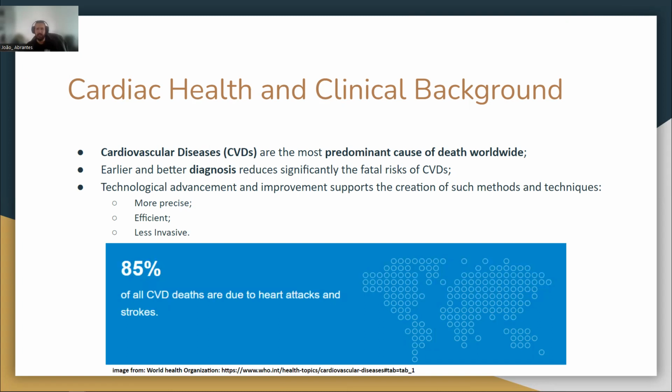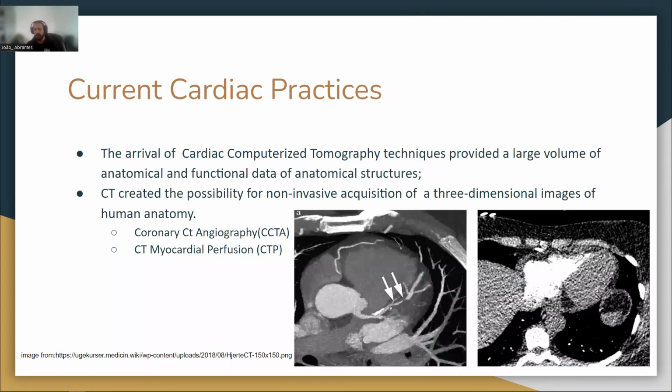Technological innovation and advancement in medical imaging led and continues to open doors for better software-assisted diagnostic solutions, making them more precise, efficient, and non-invasive. The arrival of cardiac computerized tomography allowed the visualization of a three-dimensional volume of the human heart and provided a large volume of anatomical and functional data, which led to the development of a number of technologies and methodologies for cardiac analysis and diagnosis.